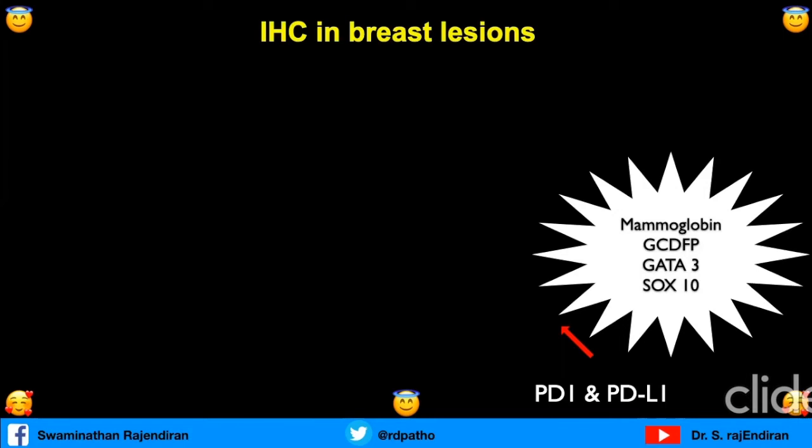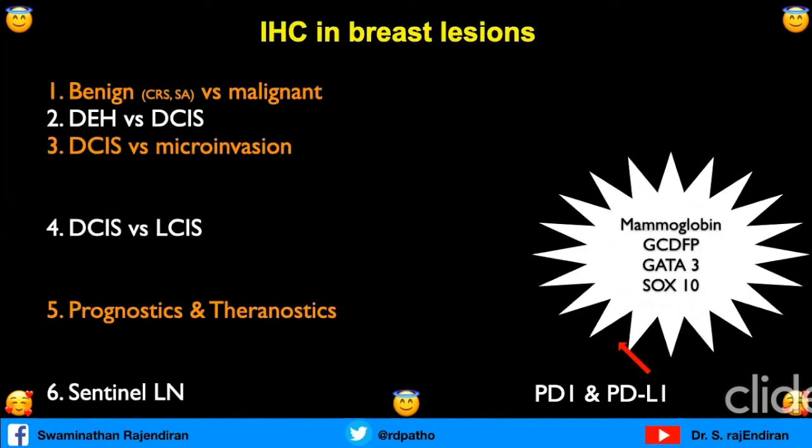Where they help in the diagnosis of metastatic breast carcinoma outside the breast, because these are breast specific markers, and you have to remember 90% or 95% of immunohistochemical markers are very good for diagnosing the cell of origin, whether it is breast or lung. But they are not saying in the breast it is benign or malignant. There is no specific marker to differentiate benign and malignant. So these markers are useful only in metastatic setup.